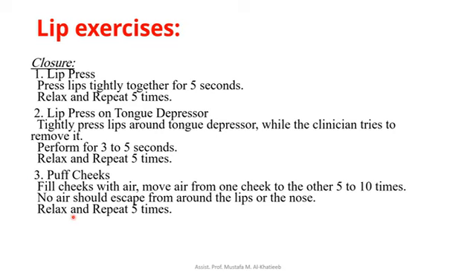Puff cheeks. Fill cheeks with air. Move air from one cheek to the other 5 to 10 times. No air should escape from around the lips or nose. Relax.